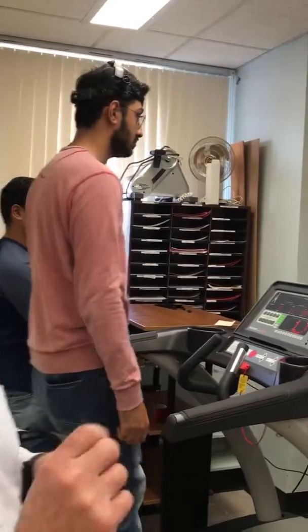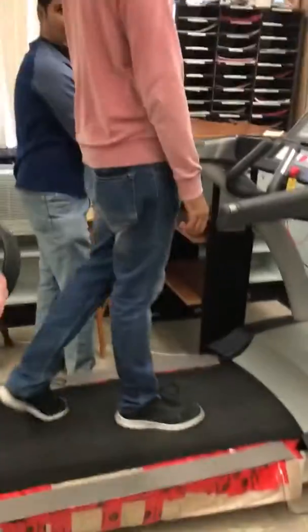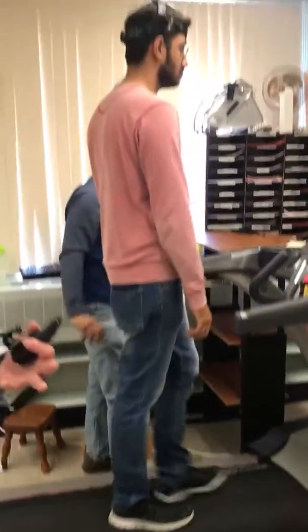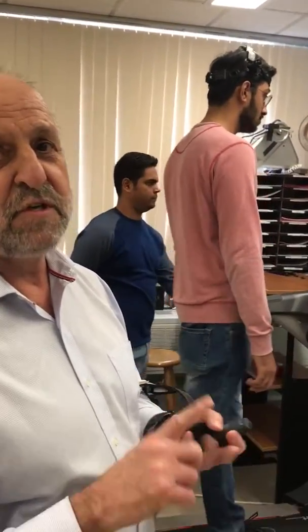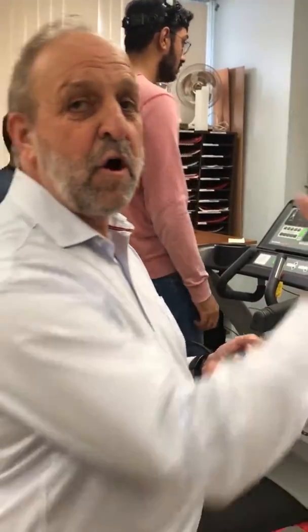We record his movements and all the game object movements. So we get 30 cognitive activities assessed in 60 seconds. Those graphs tell you his performance, his success rate, his response time, his execution or movement time, his planning time, his precision, his error rate, and his movement variation in the cognitive domain.